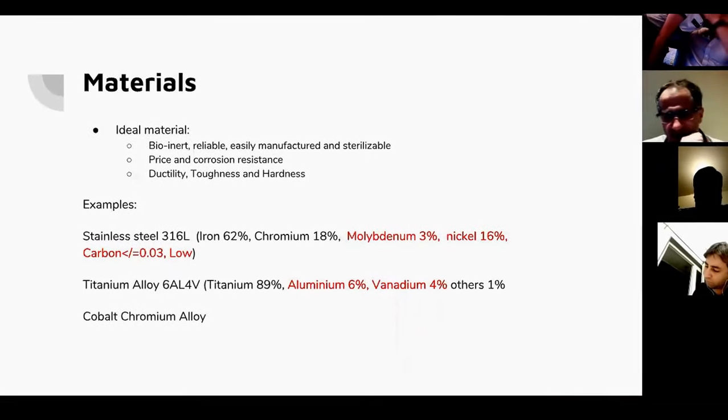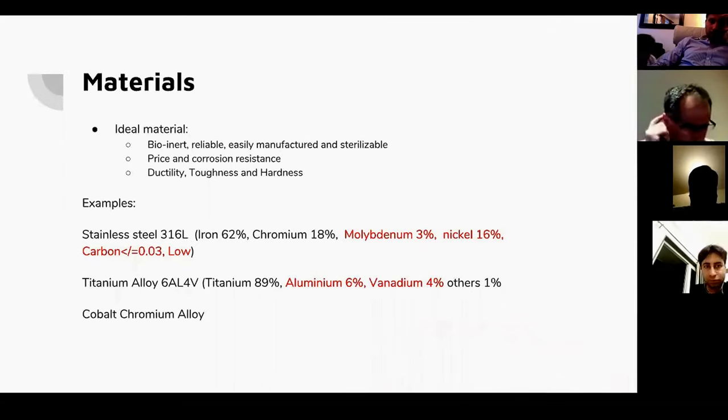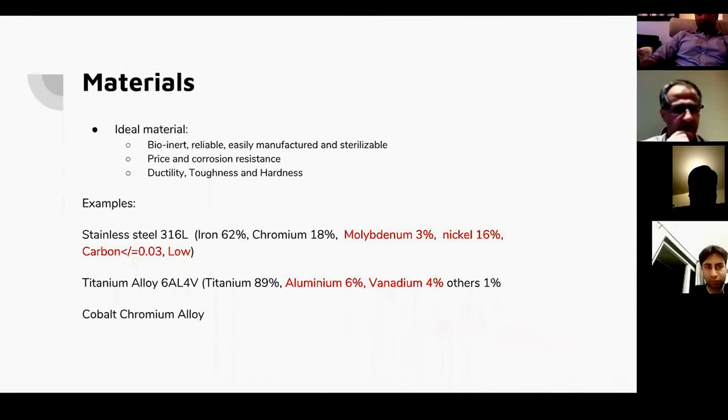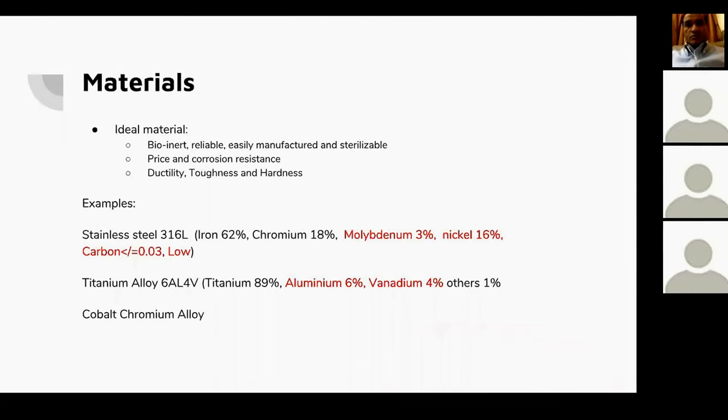The next question they usually ask is, what is titanium alloy, which we use, the 6Al 4V, aluminium 6%, vanadium 4%. Know that vanadium does have some potential ion reaction problems, and that's potentially a question that can be asked, especially if you have scratches on your titanium plate or titanium rod. But the nice thing about titanium is it's self-passivating. Okay, so that's quite a useful feature of it.